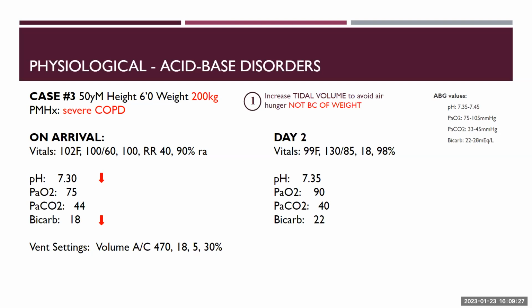Anything that you want to change? I don't know what I would change based on. So I think, Courtney, this is similar to the last patient with COPD. So let's say this patient was in the bed. I'm surprised no one's asked me what did they physically look like in the bed? But let's say the patient was really uncomfortable in the bed, even though their signs look great, like remembering to increase that tidal volume because of air hunger and not because of weight.